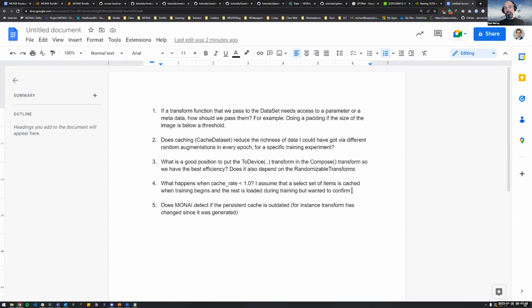Although if you want to get sophisticated with it, if you've got a small cache, you can specify orderings for your data such that if you're doing, for example, multiple samples for a subset of your dataset, all of that fits into cache, and then you move on to a different chunk of your dataset. You can get pretty sophisticated with it.